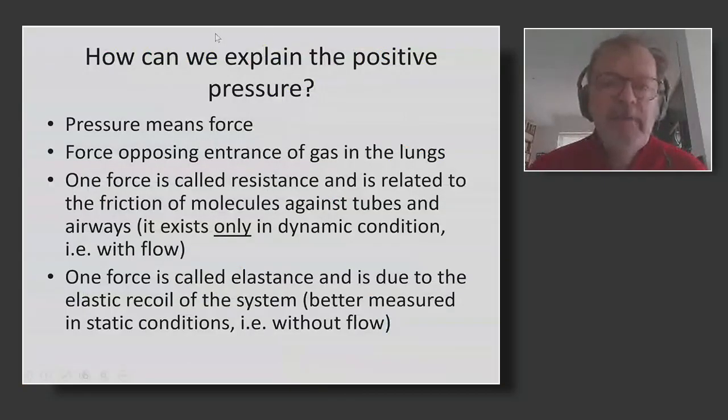So let's go back to our explanation about the positive pressure. Pressure is the force opposing entrance of gas into the lung. One force is the resistance. It's related to the friction of molecules against tubes and airway. And just understand that resistance is a concept which exists only in dynamic conditions.